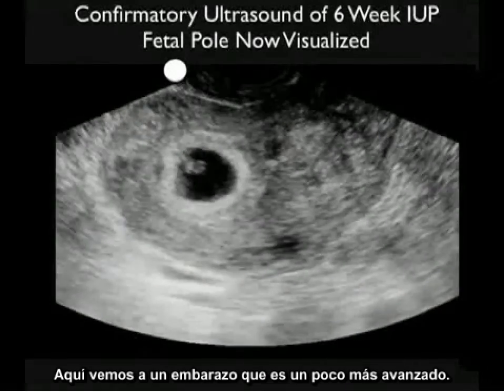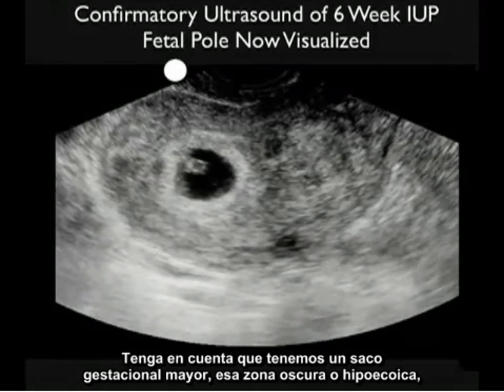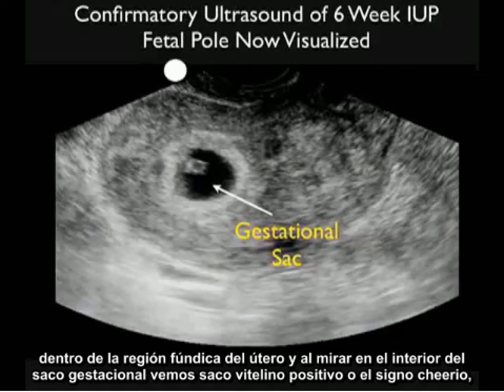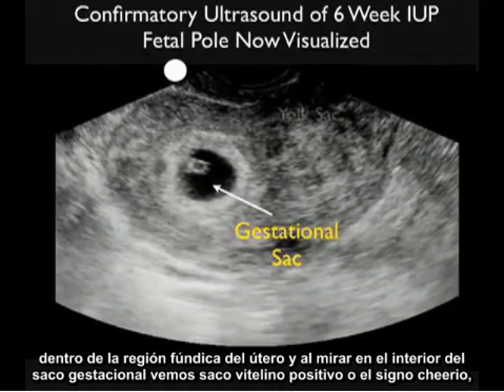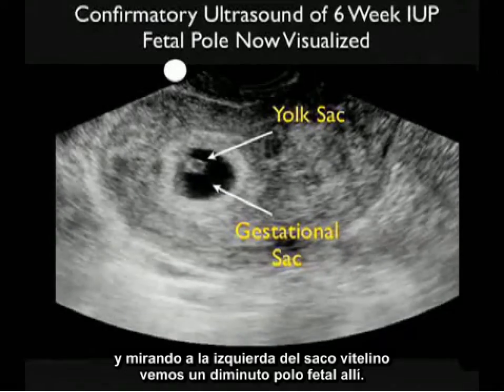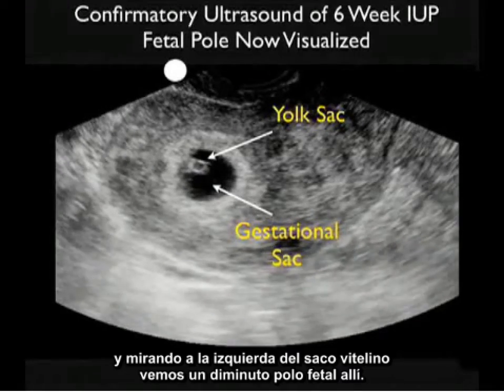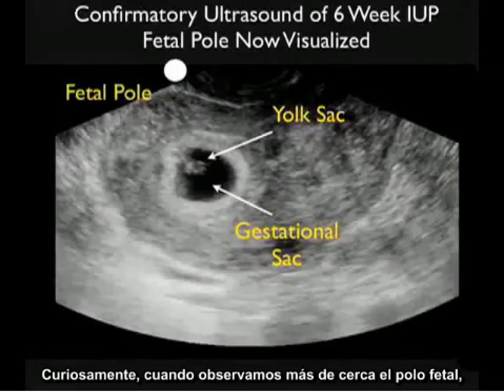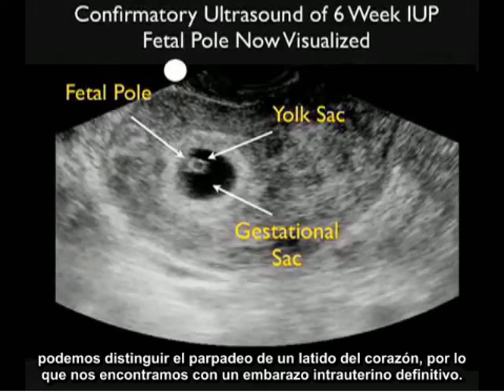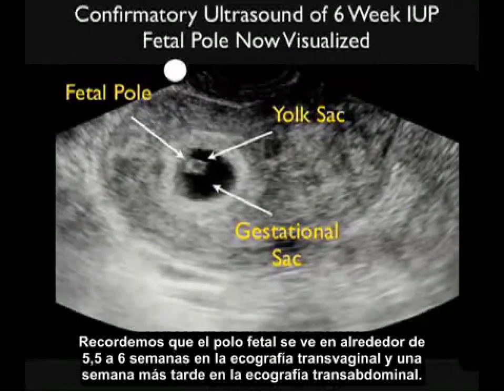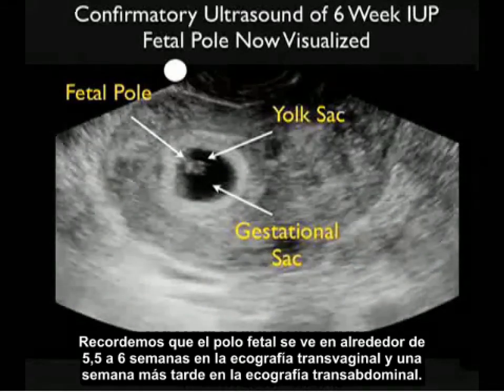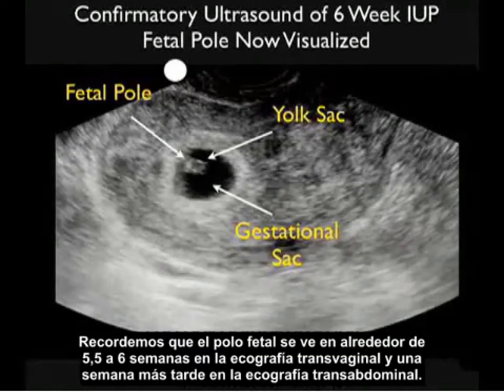Here we see a pregnancy that is a bit further advanced. Note the larger gestational sac — the darker hypoechoic area within the fundal region of the uterus. Inside the gestational sac we see the positive yolk sac or cheerio sign, and just to the left of the yolk sac we see a tiny fetal pole. When zoomed in on the fetal pole, we can make out the flicker of a heartbeat — a definitive intrauterine pregnancy. The fetal pole is seen at about 5.5 to 6 weeks on transvaginal sonography and about a week later on transabdominal sonography.